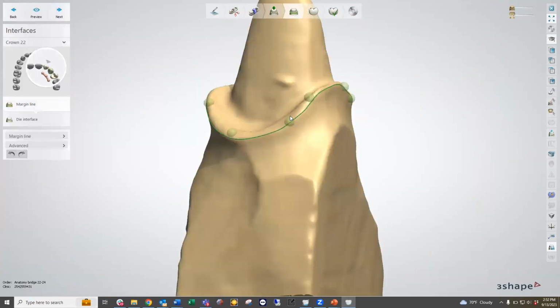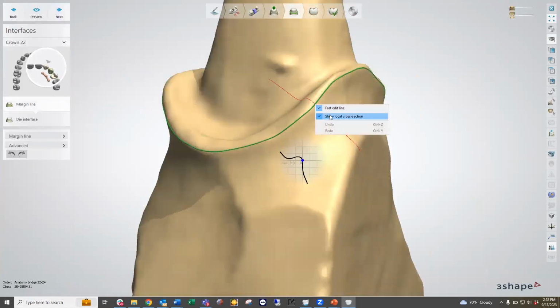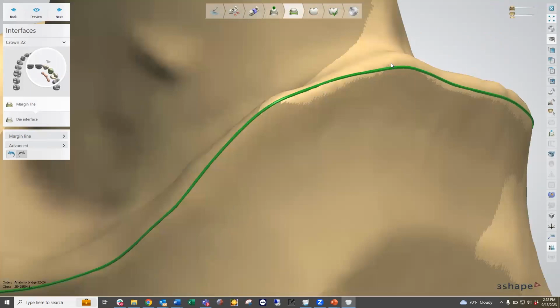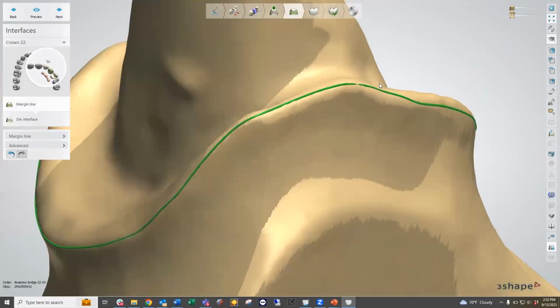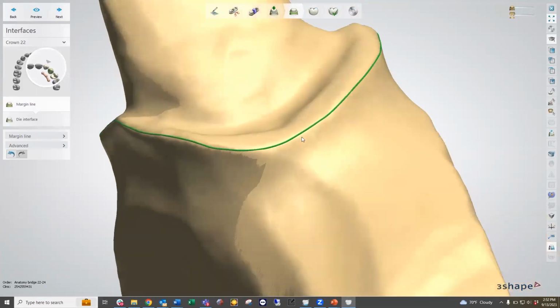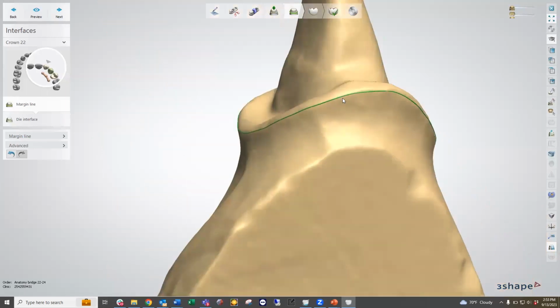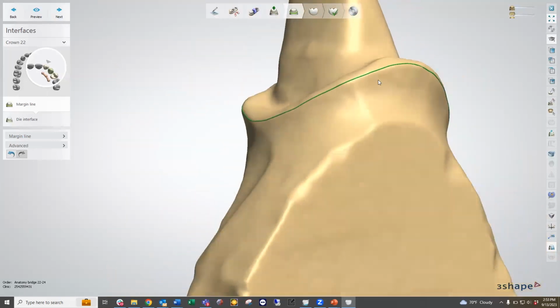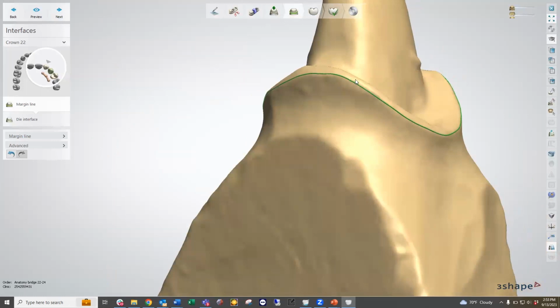Now we're going to go ahead and draw our margin line. Again, we can turn off the local cross section, which I like to do. And I like to just see exactly where the highlights are on the case as the software presents it. And then I'm going to use that as the height of contour for our margin line and make subtle adjustments for the margin. Okay, I don't want my margin sitting too low, but I also don't want it sitting too high. So I always want it to be on that nice sweet spot that we see outlined with that shadow or that highlight that we see on the model there.